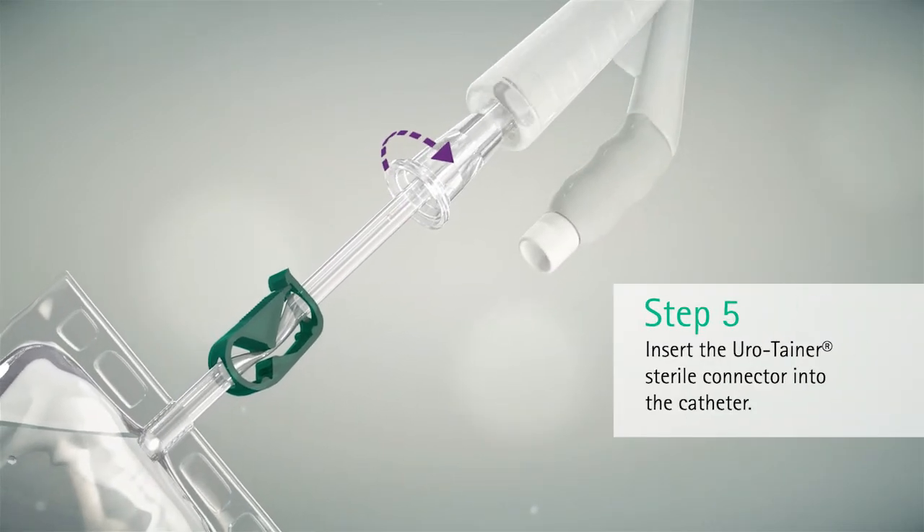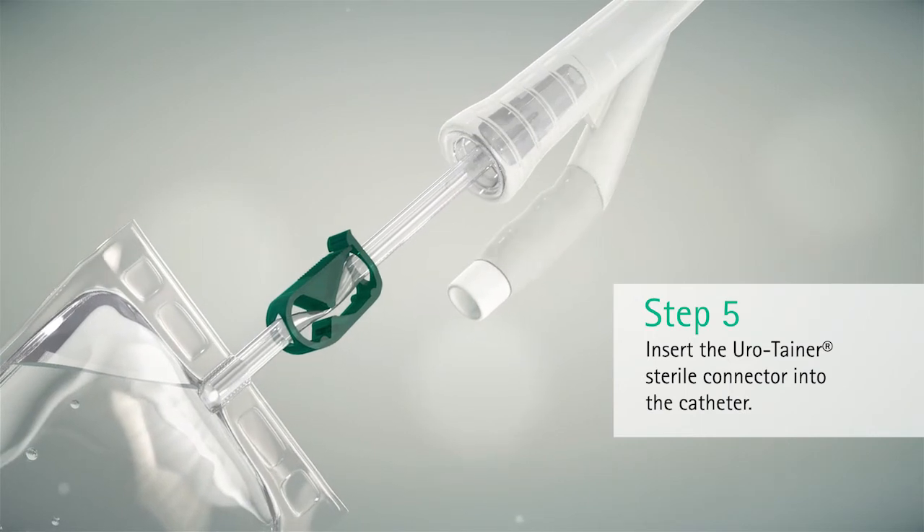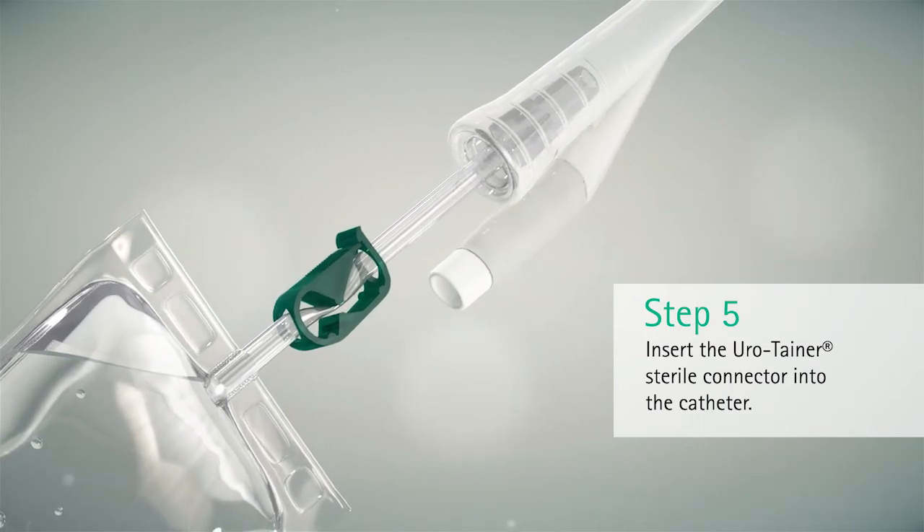Insert the Eurotainer sterile connector into the catheter. Turning slightly will help insert the connector.